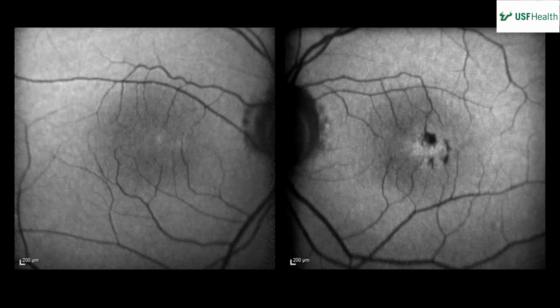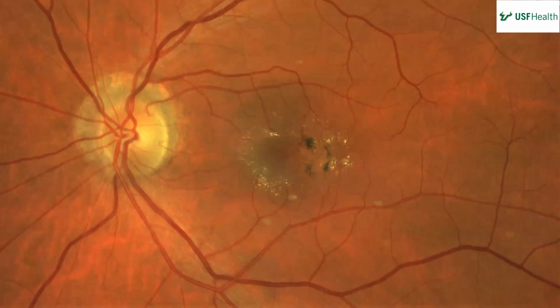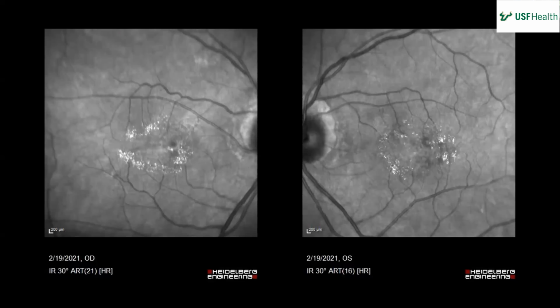The other thing is that black pigment, because it's actually pigment migration. It's like what you'd see in retinitis pigmentosa. It's where you have loss of outer retina and pigment migration. So it's almost a bone spicule next to the fovea, which is totally different from macular degeneration.